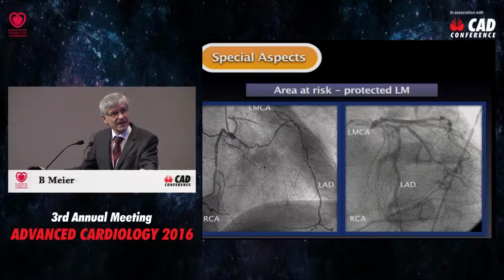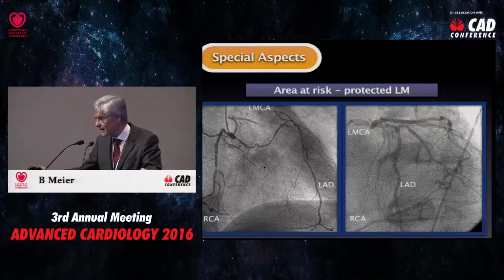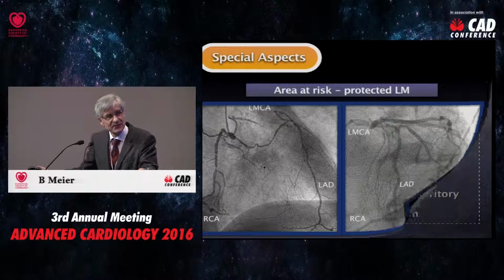Now here is such a case, again a rather old case, but it can still of course serve a purpose. You see the right coronary artery is also diseased, but you see several collaterals filling the LAD quite nicely and completely, so you're really not worried that if the left main angioplasty goes sour, the patient will crash, because he's already living on his right coronary artery as it is. So at the time, of course, nobody would do both sides during the same session. Nowadays, you'll probably even do both sides.